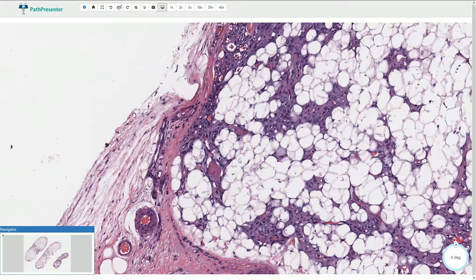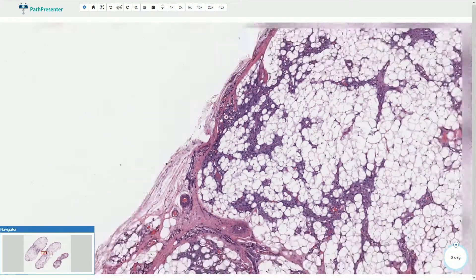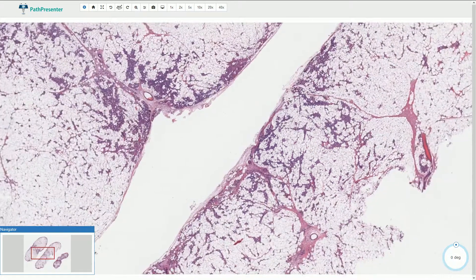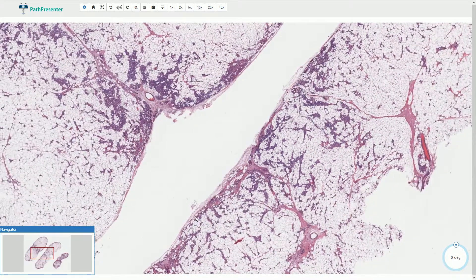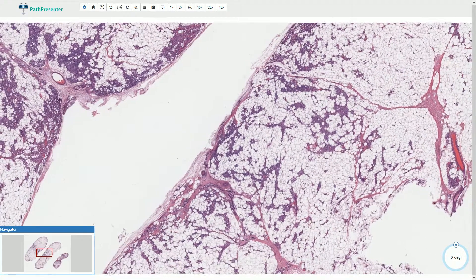Angiolipoma is a benign tumor consisting of mature adipocytes and thin-walled blood vessels with intraluminal fibrin thrombi. The vascular component can be quite prominent in some cases. On the lower magnification we can see that the tumor is well circumscribed. It has a thin fibrous capsule and is somewhat lobulated.